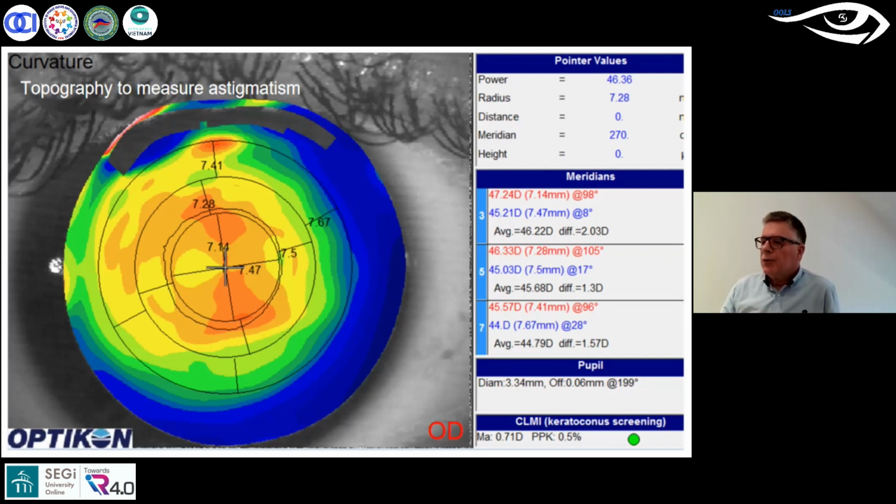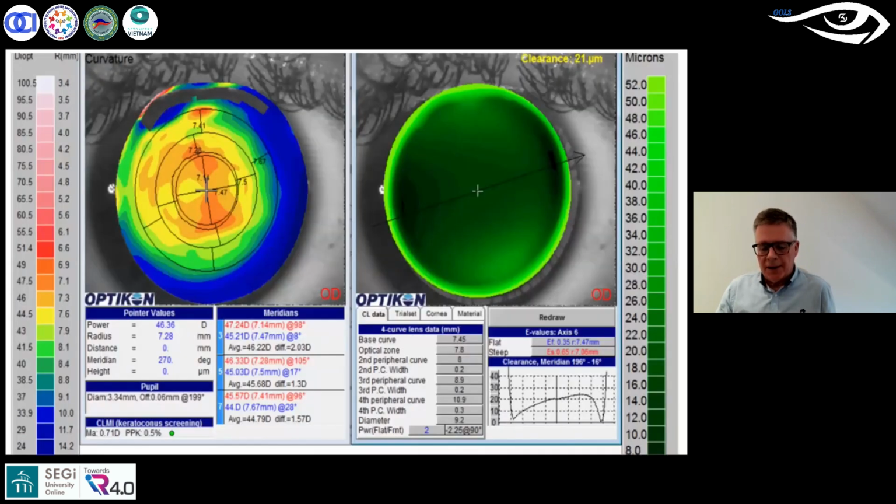And if you remember those images from 1889 of contact lenses, the Victorians knew about these. They knew about this in the 19th century, so this should not be a great surprise. And our benefit is that we can fit a contact lens from this image. This is a rigid gas permeable contact lens, and we had to do 2 or 3 minor adjustments. But what you will see here is a beautifully fitting contact lens.